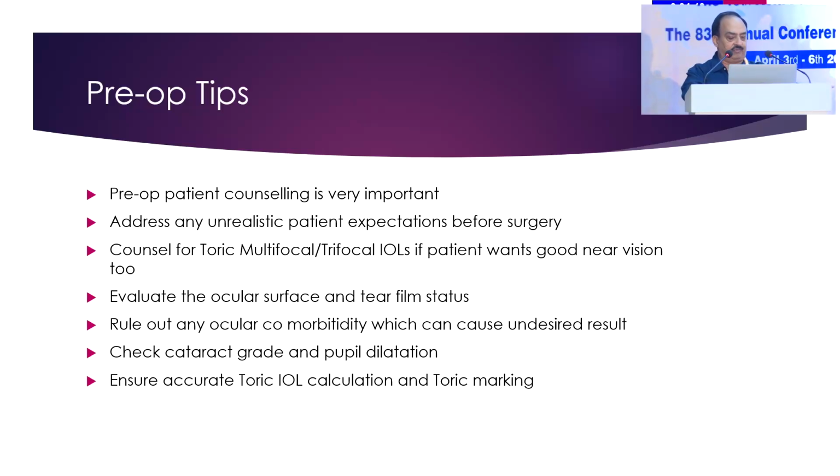Evaluate the ocular surface, I have already discussed that. Rule out any ocular comorbidity which can cause undesired results. Check the pupillary dilatation, plan accordingly, and ensure accurate toric IOL calculation and toric marking.